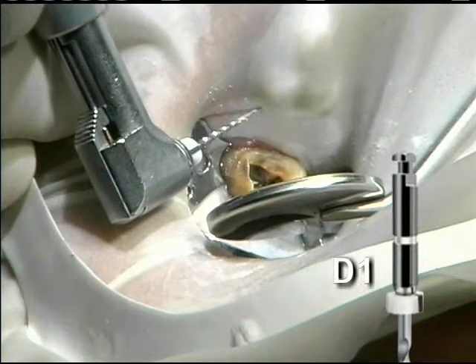Throughout the procedure, remove the instruments, inspect and clean the flutes. Then reinsert and re-engage. The D1 is used to remove the coronal one-third of the obturation materials.